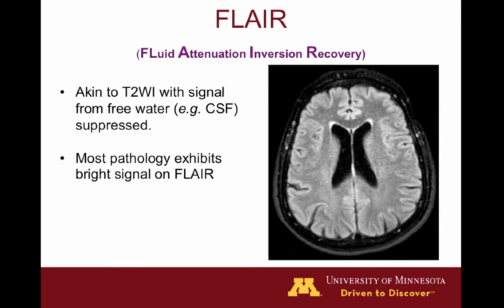Next we'll talk about FLAIR images, which stands for Fluid Attenuation Inversion Recovery. One way to think of FLAIR images is that it's a super T2-weighted image that only has the water removed — now that's a drastic oversimplification — but you'll notice on this image that the ventricle signal is dark, and the CSF within the sulci is also dark. In order for fluid to be nulled on this sequence, it has to be very watery.